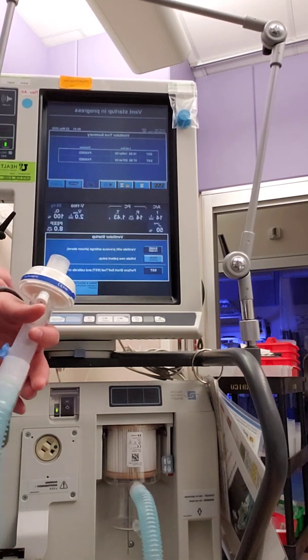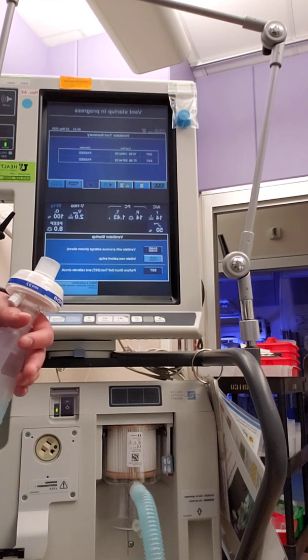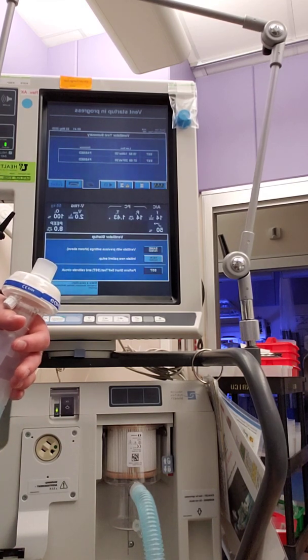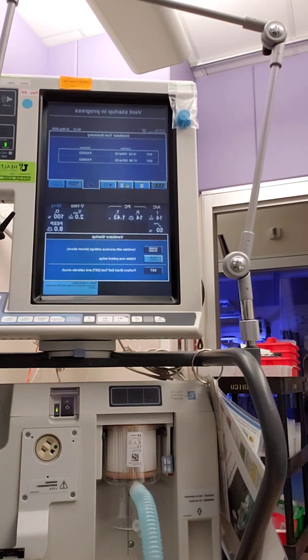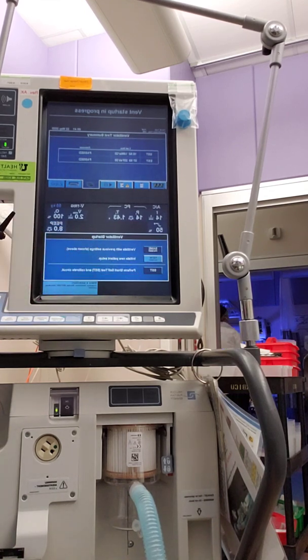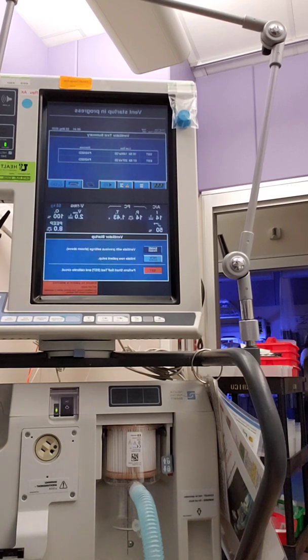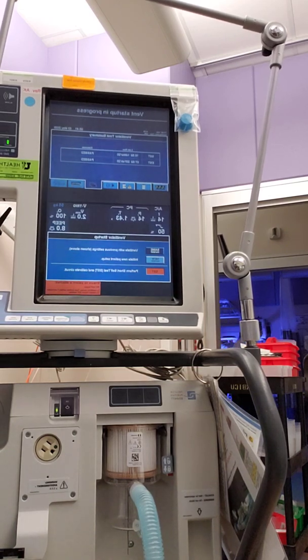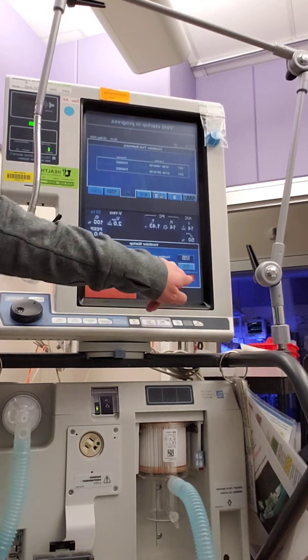New patient is if you're setting up for the very first time, this patient is freshly intubated or coming from the OR, or a transfer in from a different hospital, so that you can start putting in settings and height for that patient. This bottom one is SST. It's a self-test to help calibrate the circuit and the ventilator. So we can press SST, and then over here it says accept. This is the accept button. So you press SST.